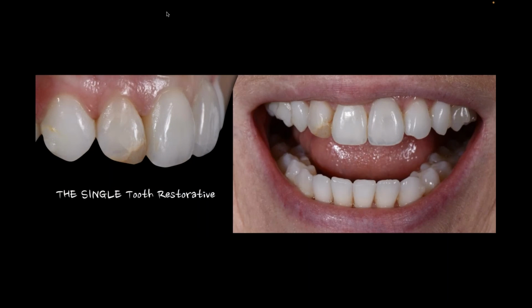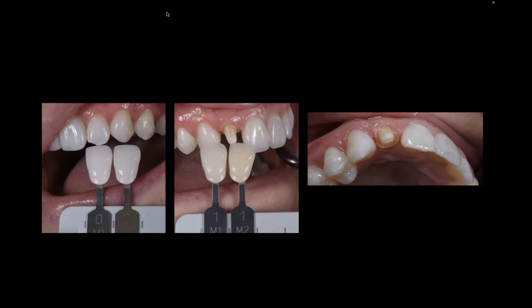And I think this is most challenging for us when we're doing single tooth restorations, right? So this patient has most of all their natural teeth. I have a little chip on the number 10 there, but I have to match that one tooth, and that's kind of the biggest challenge. And this is where it's important for us to really walk through that shade taking process.